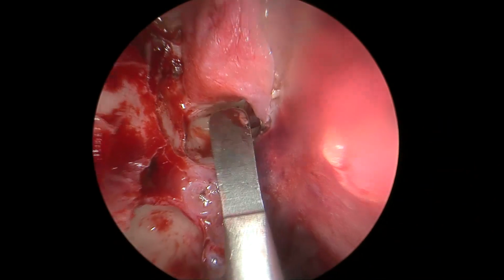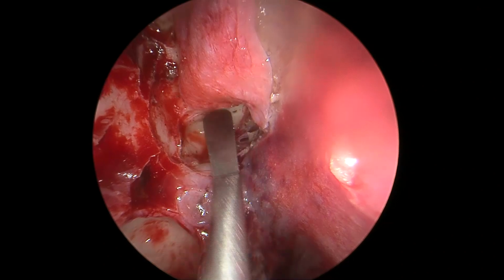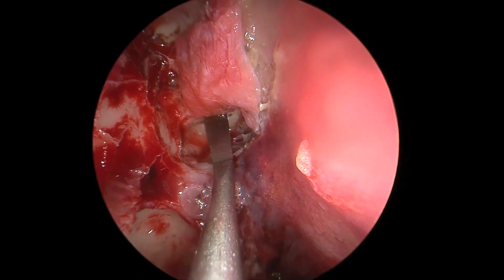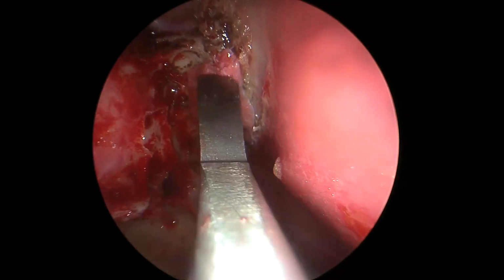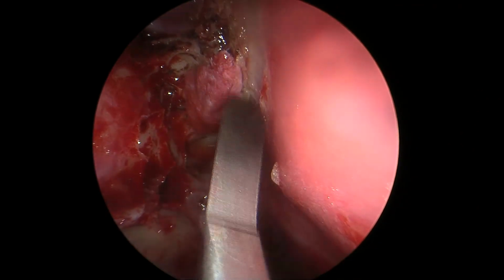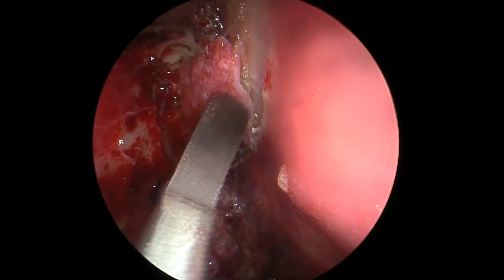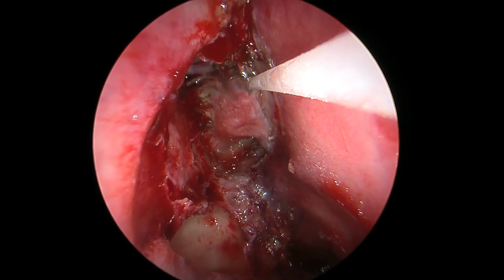And once it is nicely set, at this level we normally use our tissue glue to set the first two layers well over this bone, and over this tissue glue we will eventually be using our free mucosal graft. It's very important to not let your fascia graft be rolled up, just like you do in tympanoplasty.